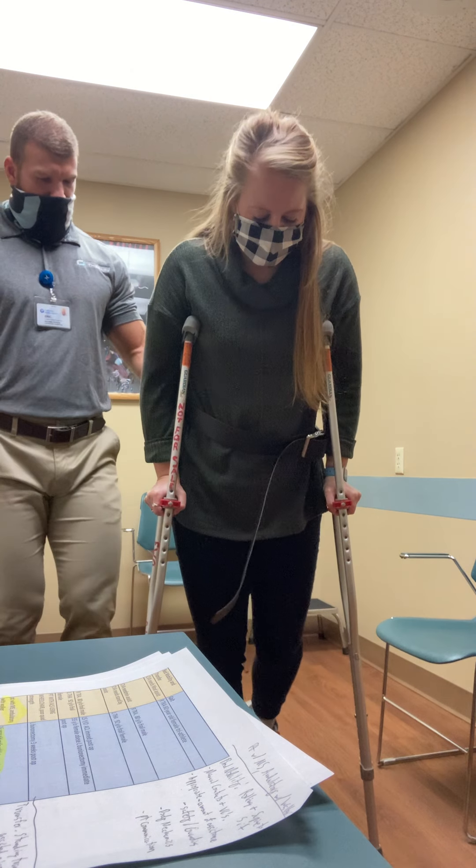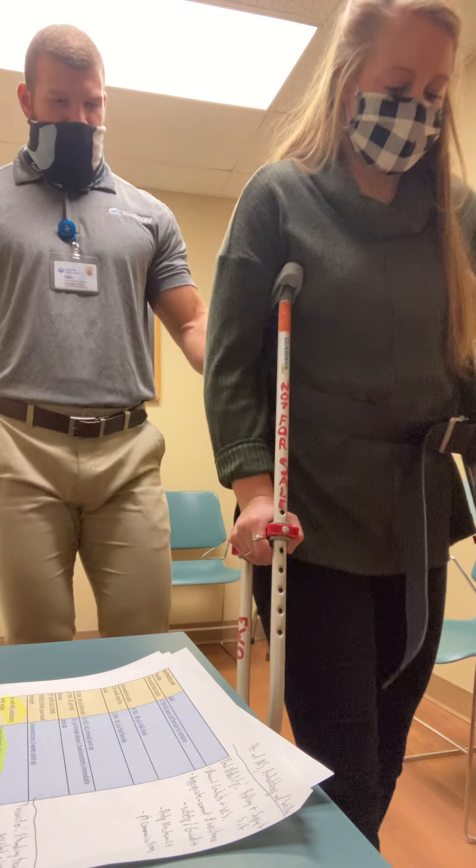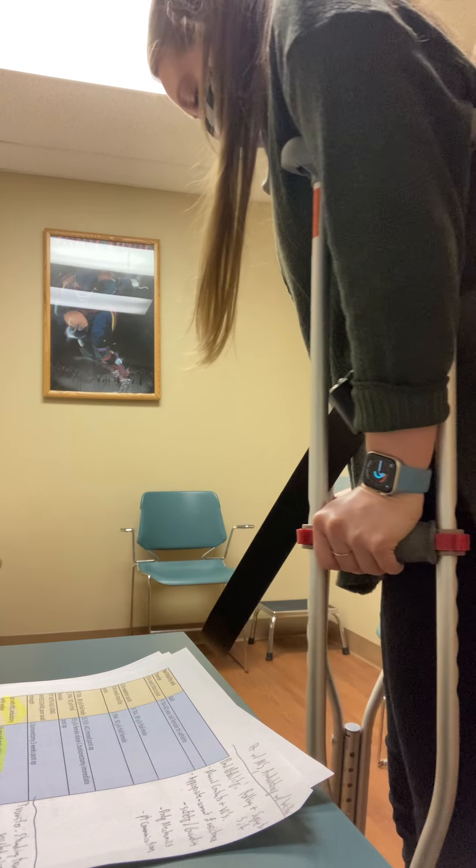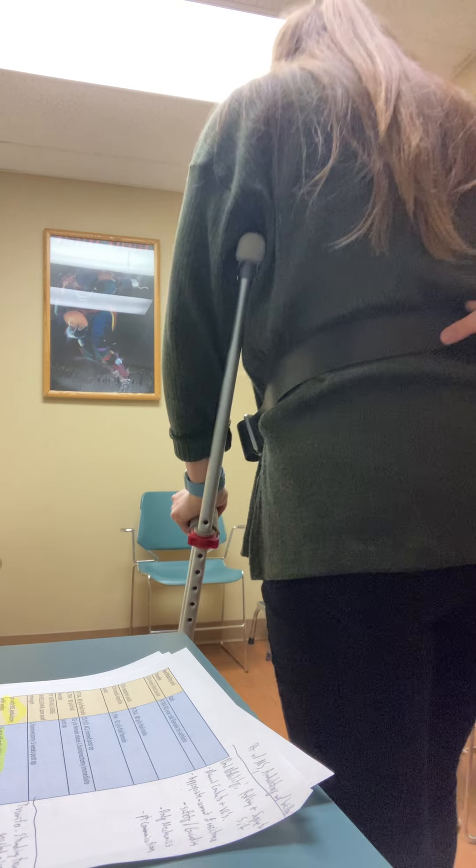Step in, stepping through. Step in, stepping through. Let's turn around and go ahead and sit down.